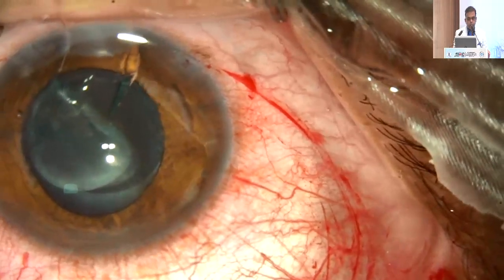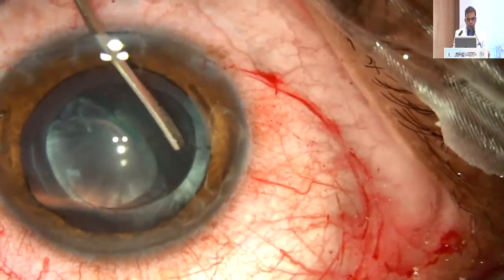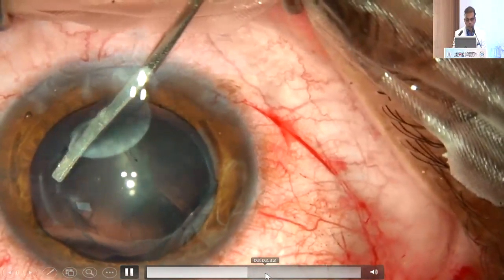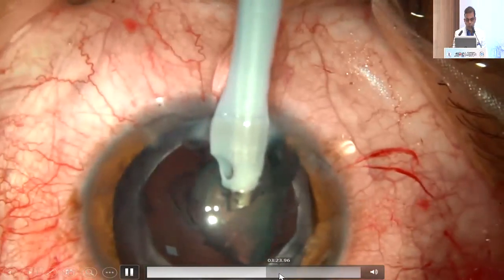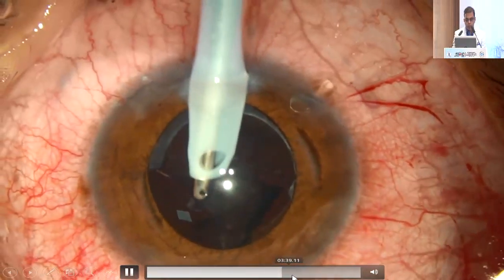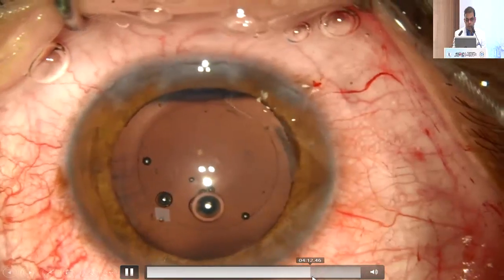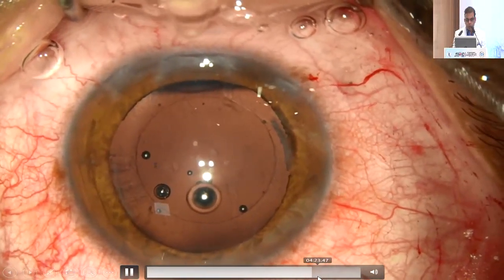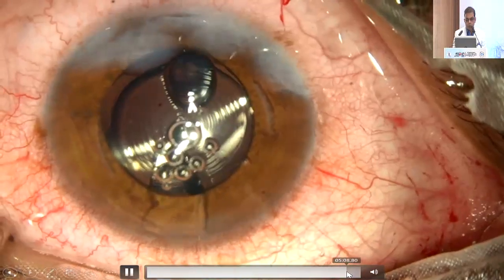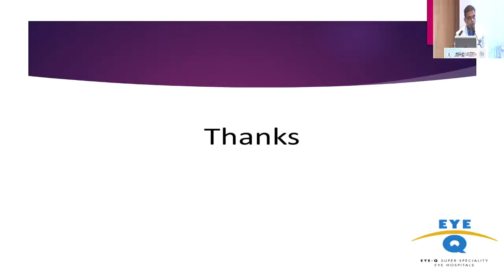We used the same 3 mm incision. The free-floating rhexis, as you can see, is coming out. The rest is routine cataract surgery with a soft lens, so not much phaco was needed. Irrigation and aspiration was done, and the Synergy IOL was implanted with a good result on the first post-op day. We found that this combined procedure can be done successfully. Thank you very much for your patience.